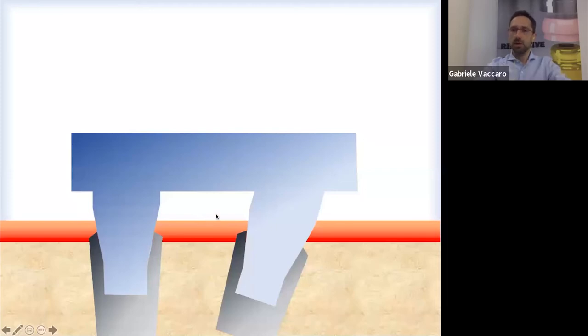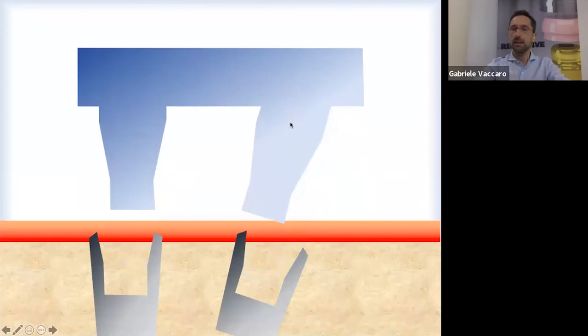When I extract the impression from the implants, I produce a distortion of the implants, because to take this out from here, I need this implant to move from its position, exactly like this. And this distortion is the first step of loss of passivation. So passivation begins in the hand of the dentist, not in the hand of the technician, because we are giving the technician an impression that has some distortion inside, because I moved this transfer and it has lost its original position.